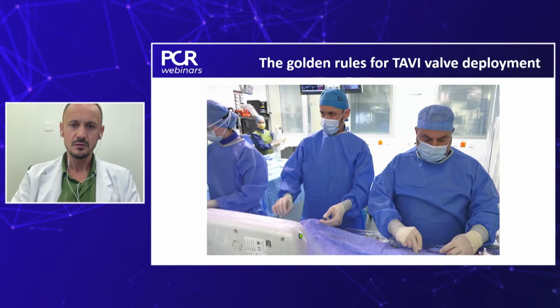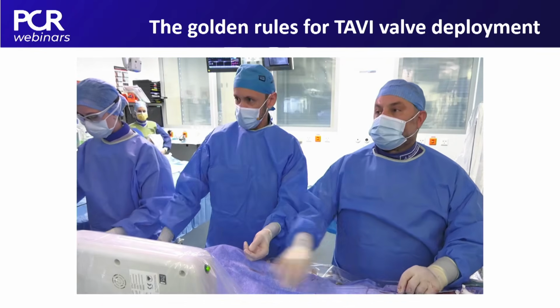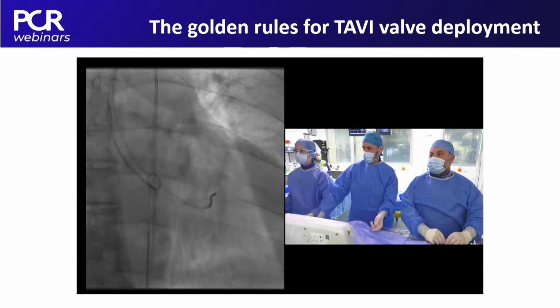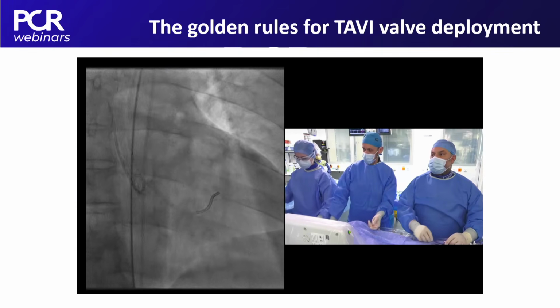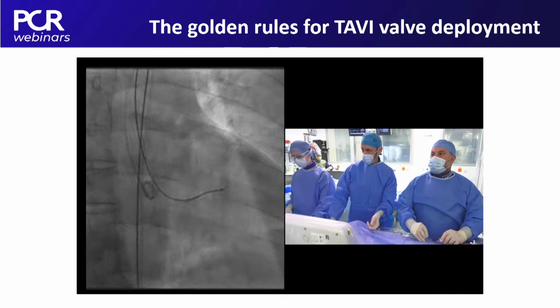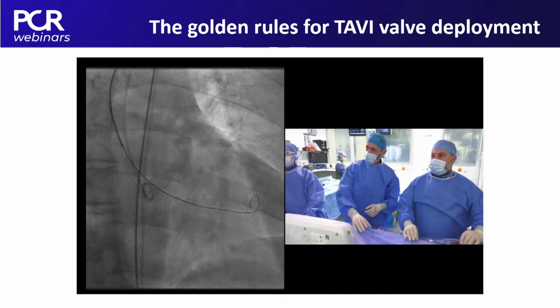Okay, Mauricio, so good, safe vascular access is achieved. Take us through the steps of deploying the Navitor system. Yeah, let's move to the valve implantation. Our standard setup, if there are no electrocardiographic abnormalities, is to pace over the wire during the procedure in order to spare one access. And in this case, you are going to pace over a pre-shaped wire.